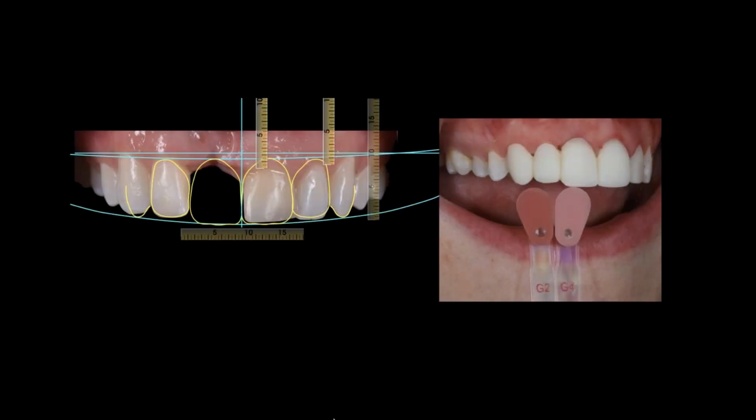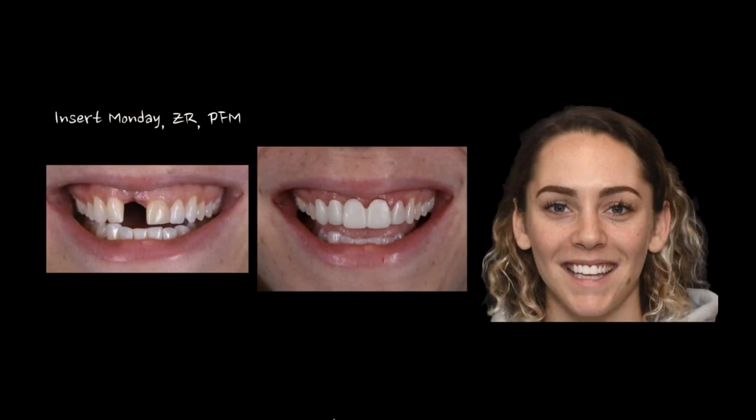To go forward with this case, we actually went back to the original plan, the original wax up. We took some pink shades and we did everything that we normally would do. Because we were documenting this case, if I'm not mistaken, Jim, you may have a whole video on this case that you guys actually shot when we did this. So that would be kind of cool to release one day.